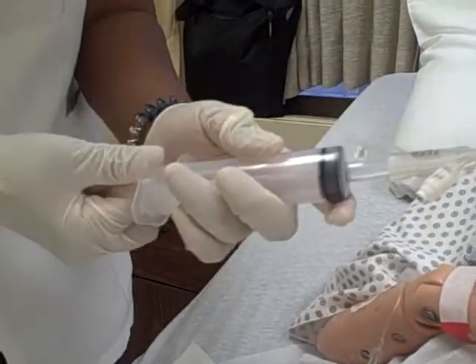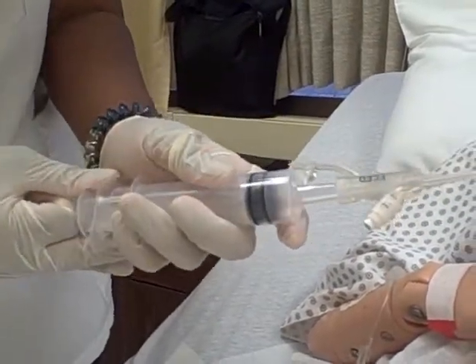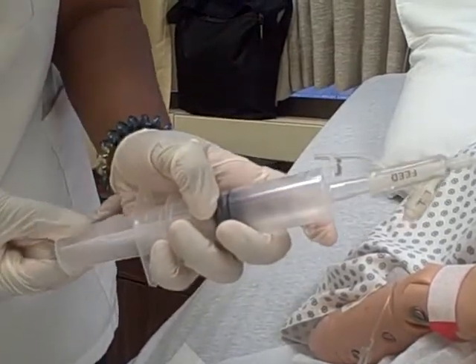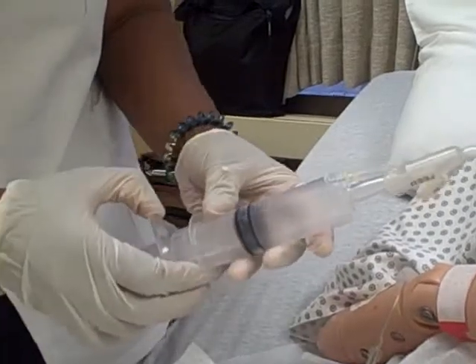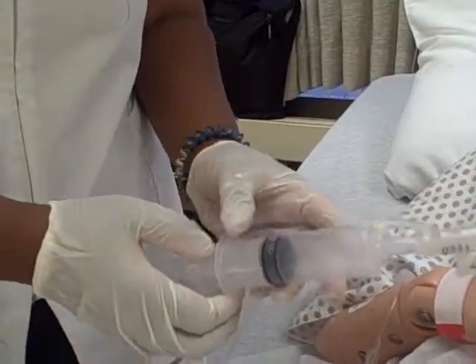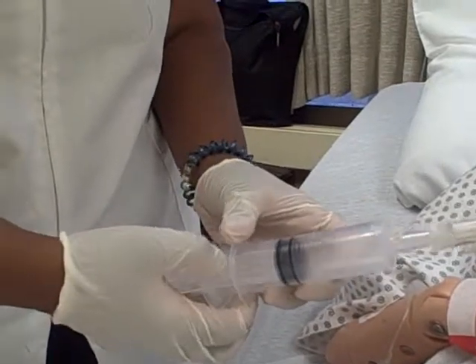I want to draw back on the plunger, and I want to note the color, consistency, and the amount of the gastric contents.